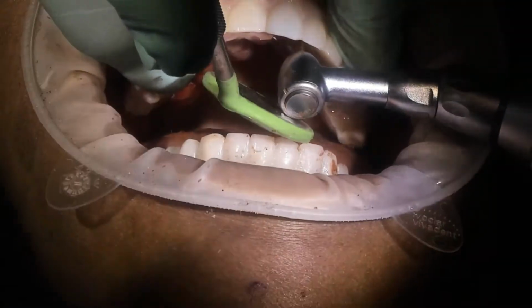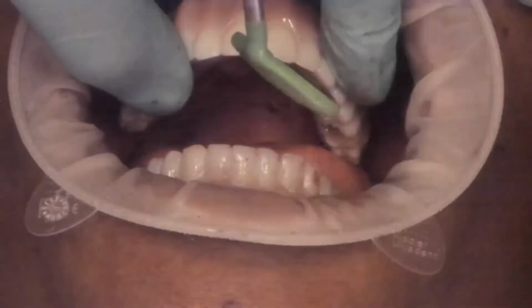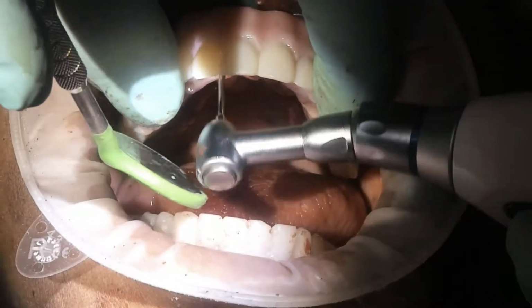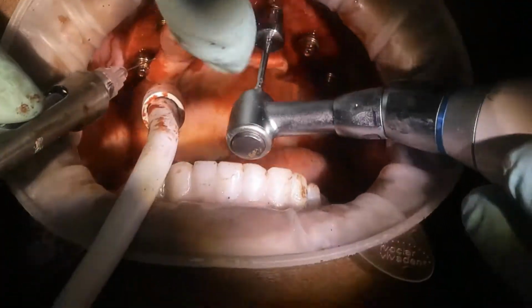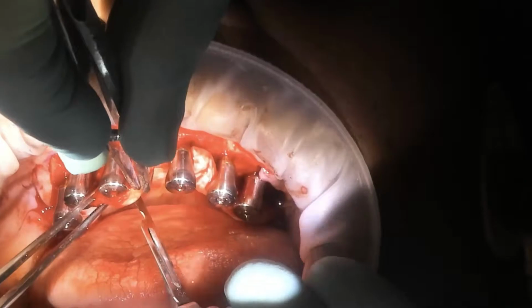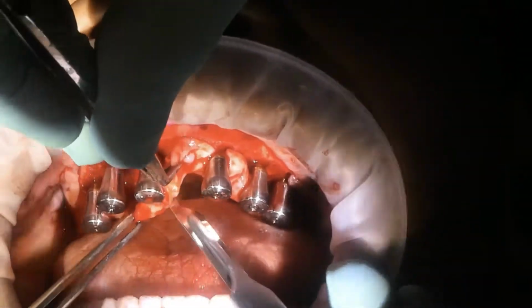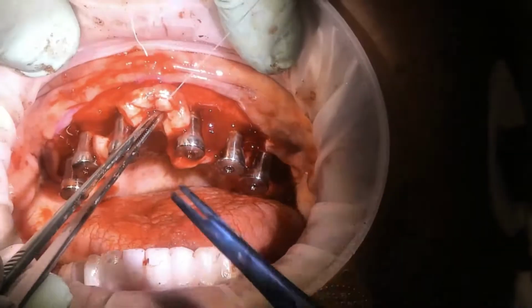And you can use that backup as a way to transfer the records to the laboratory. It's a simple process to transfer all the records: implant position, tooth position, occlusion, bite, everything. Very handy. Then the rapid appliance is removed with the blockout gaskets and the carrier guide, and then the fixation base is also removed. If the doctor chooses, comfort caps are placed, and the patient is sutured, and then we move on to the opposing arch.